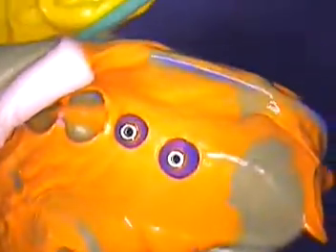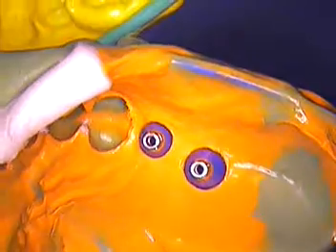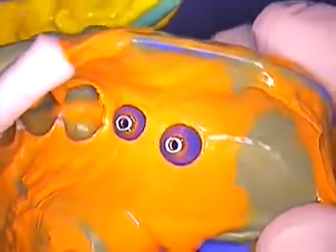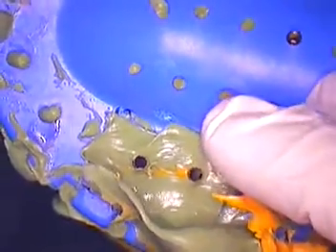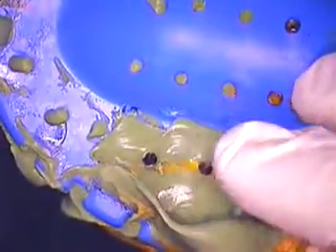Hello, and we're back. This is Dr. Jerry Cuomo. I'm here in Boca Raton with Ernestine's case, and hers is a bone level — a Straumann bone level case where we joined these two abutments in the mouth. We took our impression now. I wasn't able to show you the actual impression taking, but if you can imagine an open tray that was cut out — we cut a square out for the two impression coping screws.